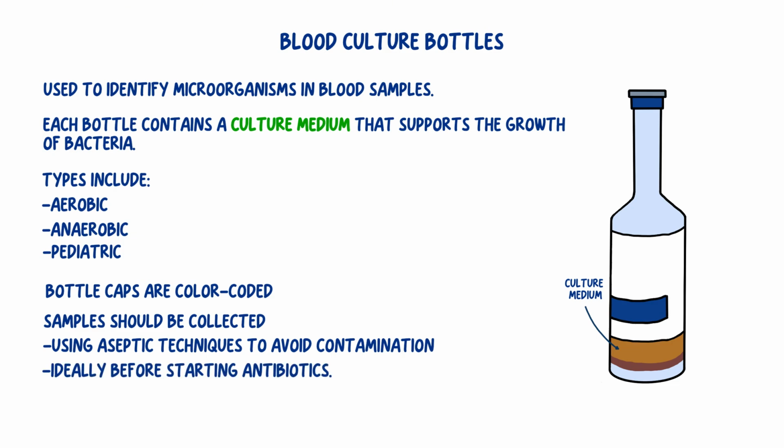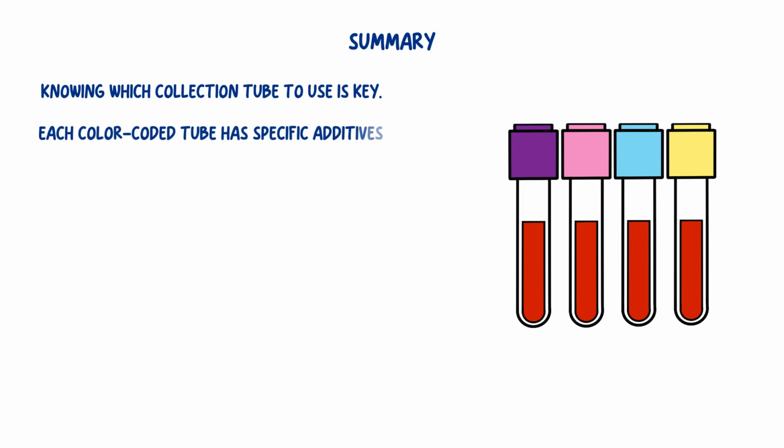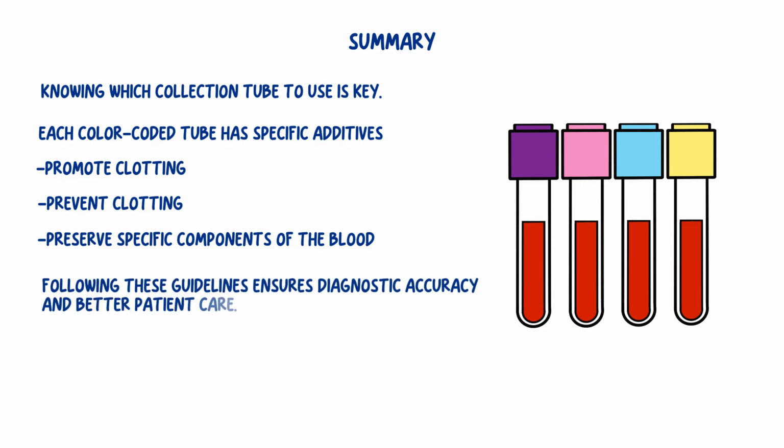ideally before starting antibiotics. In summary, knowing the different blood collection tubes and their uses is key to accurate lab results. Each color-coded tube has specific additives to either promote or prevent clotting or preserve blood components, ensuring sample viability for various tests. Following these guidelines ensures accurate diagnostics and better patient care.